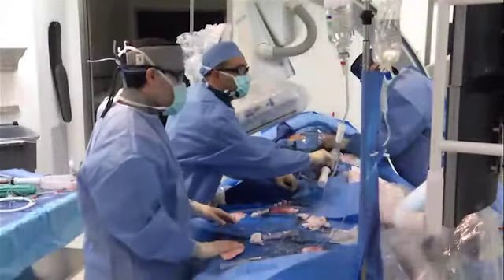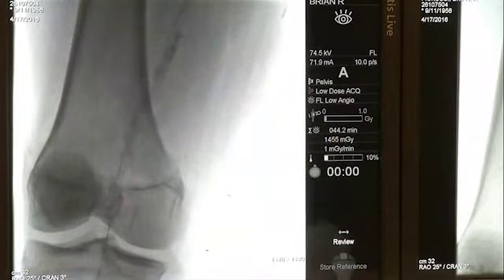So here we're coming down. It's going easy, as you can see. So go down a little bit more. Right there. So I'm going to hit this part again with a 6-0.